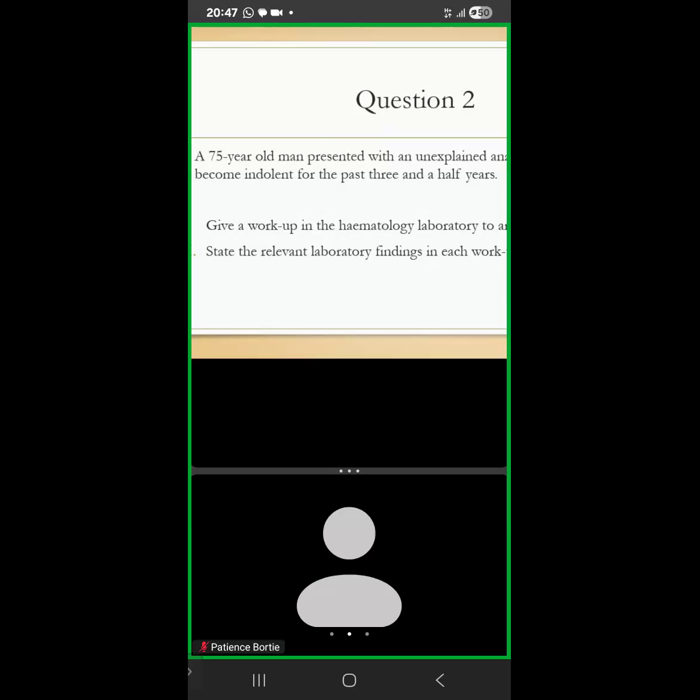So we'll query a myelodysplastic syndrome and walk through the motions of a workup and see what it comes out with. Again, a full blood count: pancytopenia. Differentials will be aplastic anemia, MDS, PNH, very similar. Peripheral blood pancytopenia, morphologies like we did previously. If indeed it is a myelodysplastic syndrome, we'll see dysplastic changes. We go through our bone marrows. In MDS, the marrow is hypercellular, and the other things that will come.